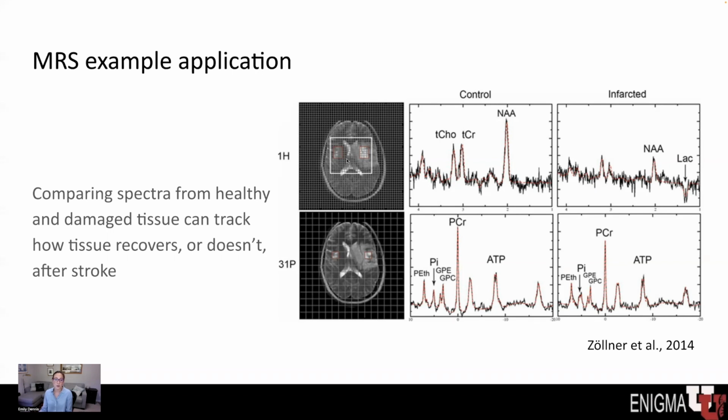So we can use this here in this example. The patient can be their own control. You can compare the damaged area to the healthy area. And we can use this to track how tissue recovers over time, or in some cases doesn't recover over time.